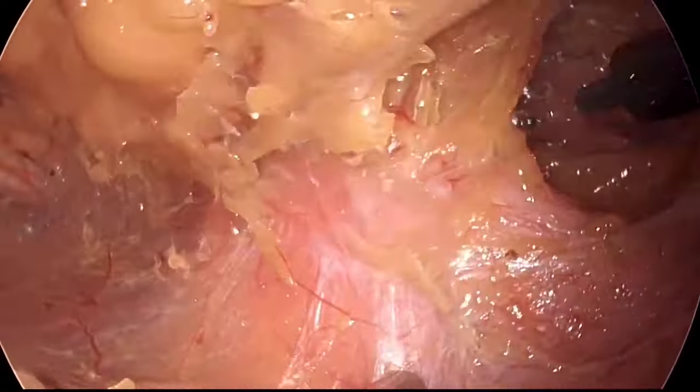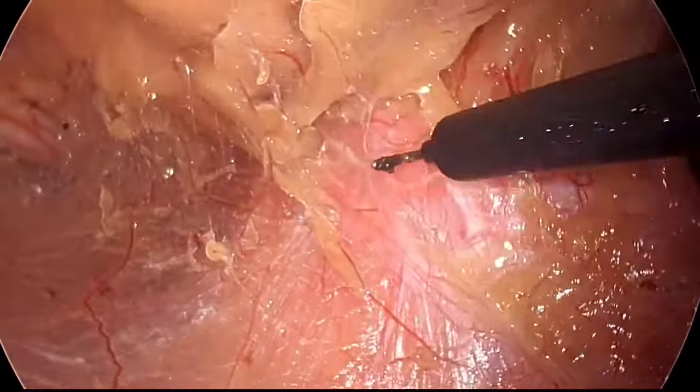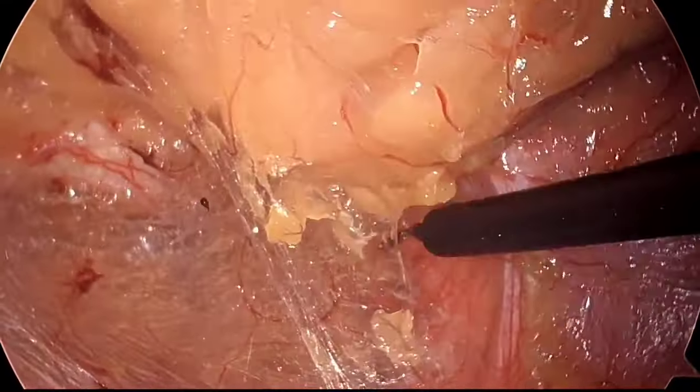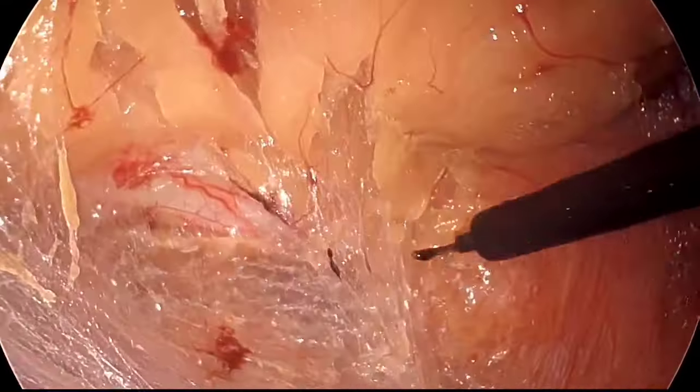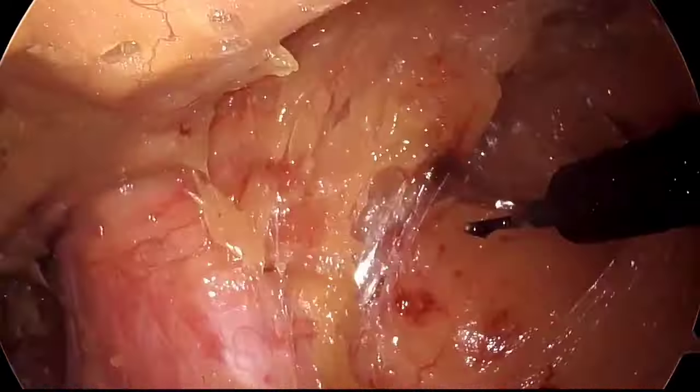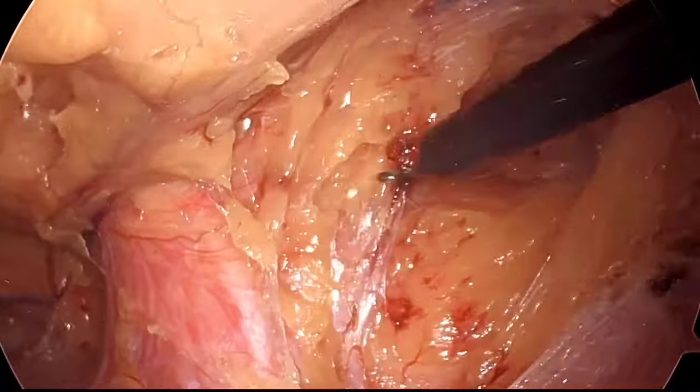So the idea is to create space all around the defect area, and then I'll be targeting the hernial sac. So the medial space is getting created, the lateral space is created a little bit, and then I'll be creating further space.